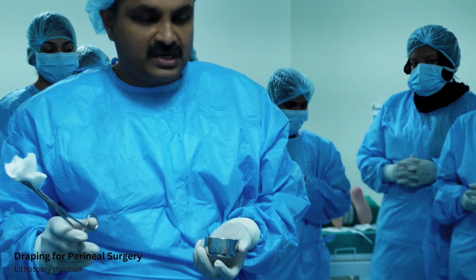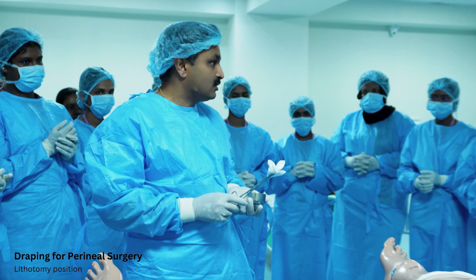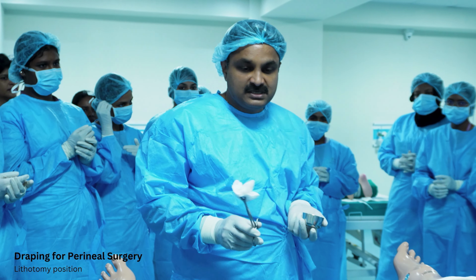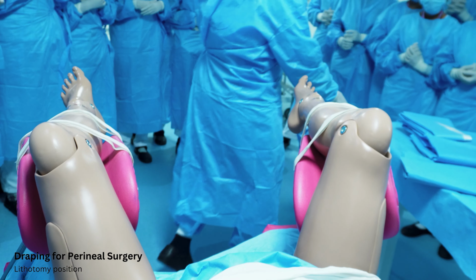The only thing is, when you are cleaning the genital area where the mucous membranes are, never use alcohol or povidone. Some simple antiseptic is fine. So, I just clean the area and discard it.